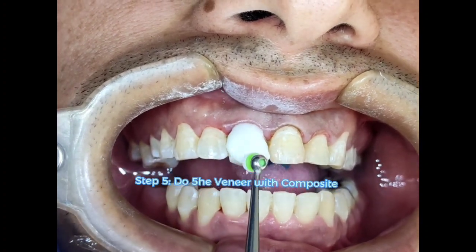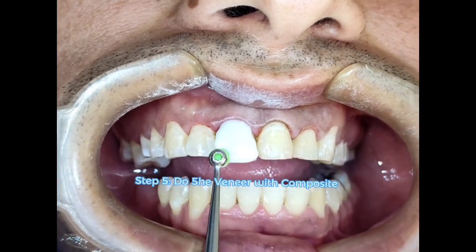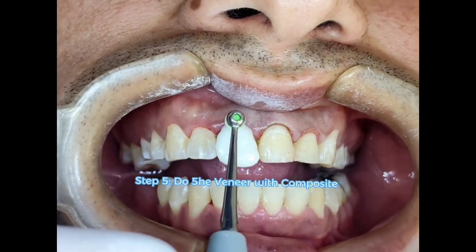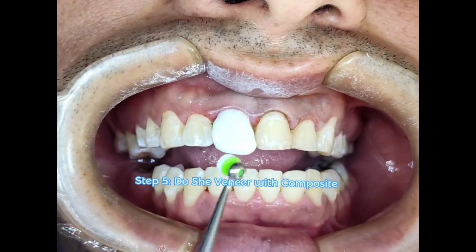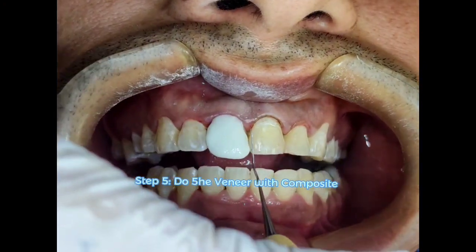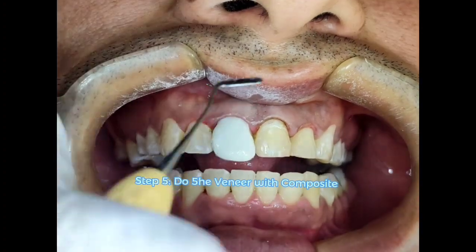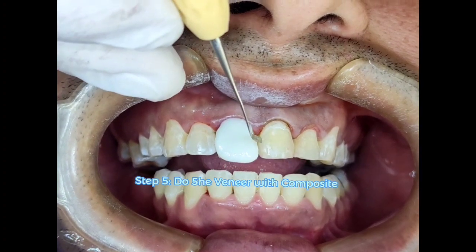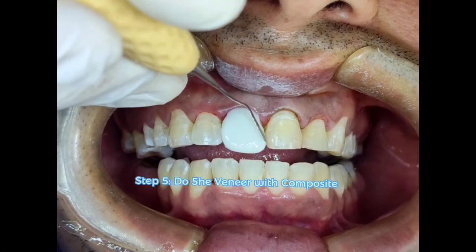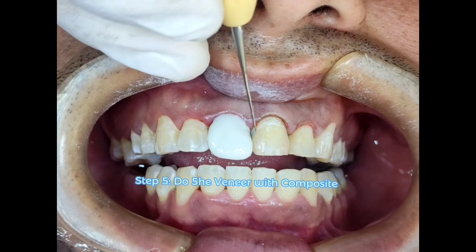But in a different situation, you do the veneer only on the tooth with the crown. In this situation, you need to find a color very similar to the other teeth. But in this case, I am going to do a set of veneers. For this reason, I use a very white color. And I start to do the new shape.